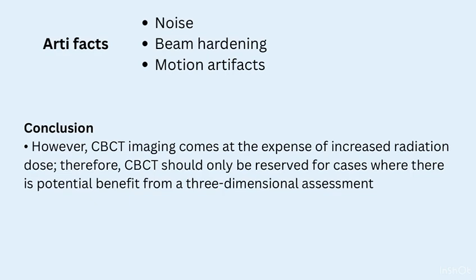X-ray beam artifacts that arise from the polychromatic nature of their projection lead to beam hardening, which is the increase in average energy as a result of low energy photons being absorbed instead of high energy photons. Motion artifacts, in which a misalignment occurs of either the source, the object or the detector, cause inconsistencies in the process of back projection.